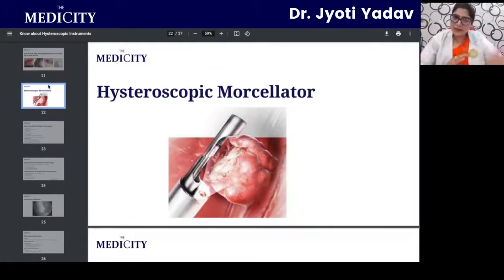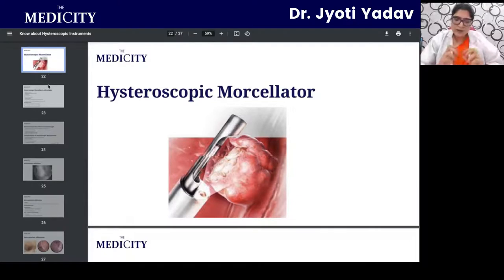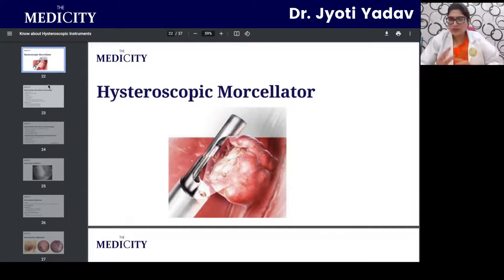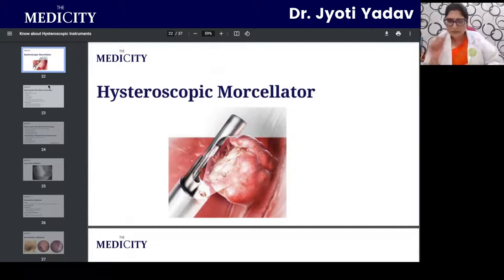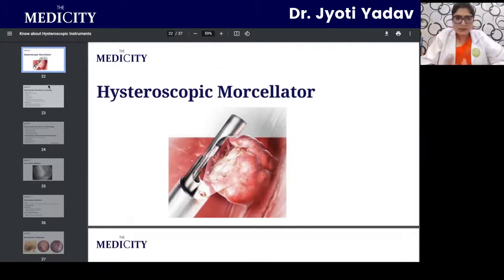An important instrument in operative hysteroscopy is the morcellator — it can remove even huge fibroids. With this instrument we keep dissecting and biting, and the whole fibroid is chewed up and removed.